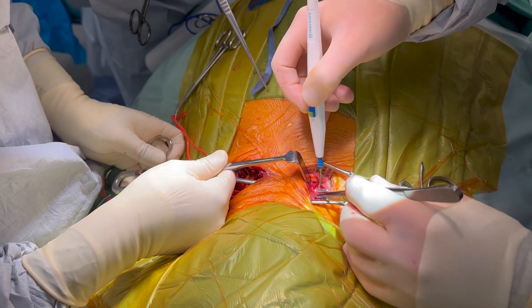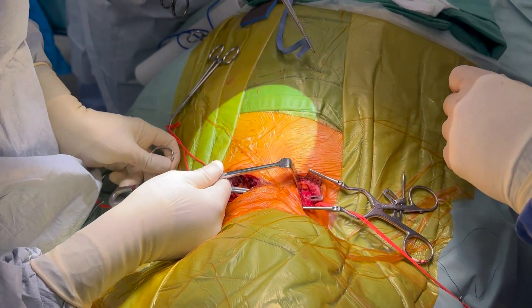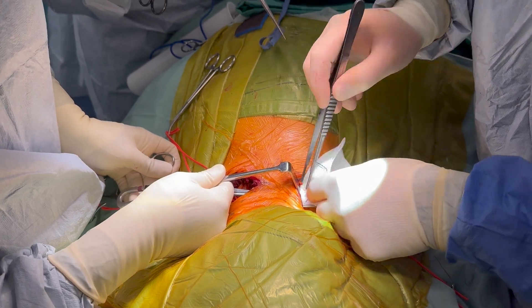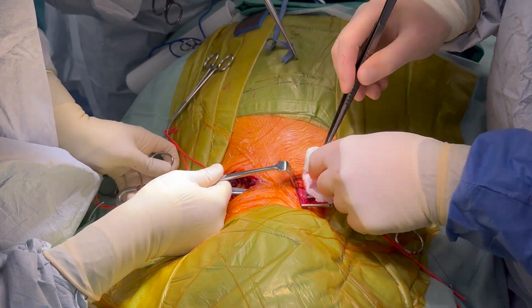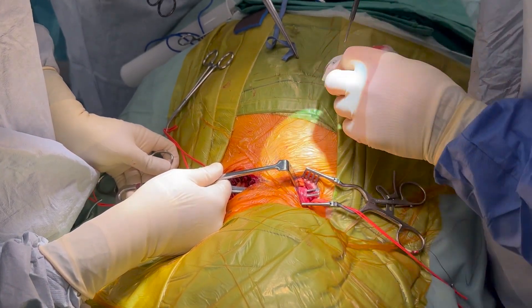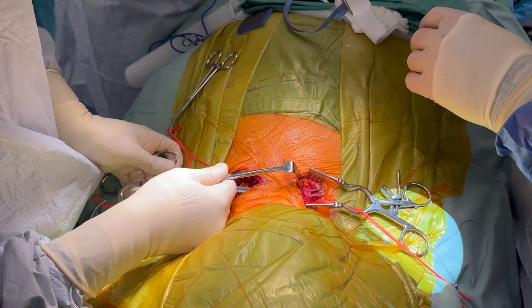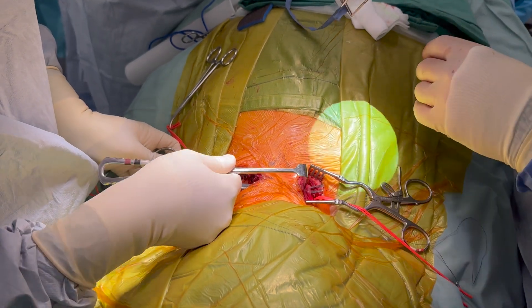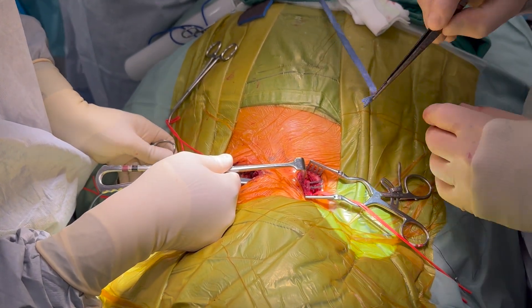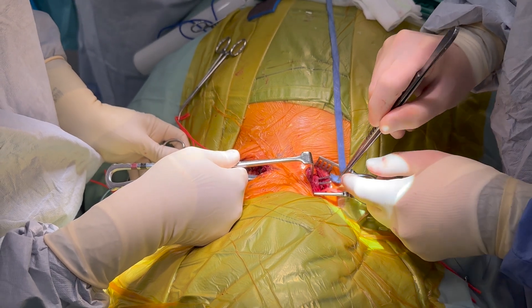We're going to use a polytetrafluoroethylene ring-reinforced 8mm graft, which is also impregnated with heparin — a Propaten graft.